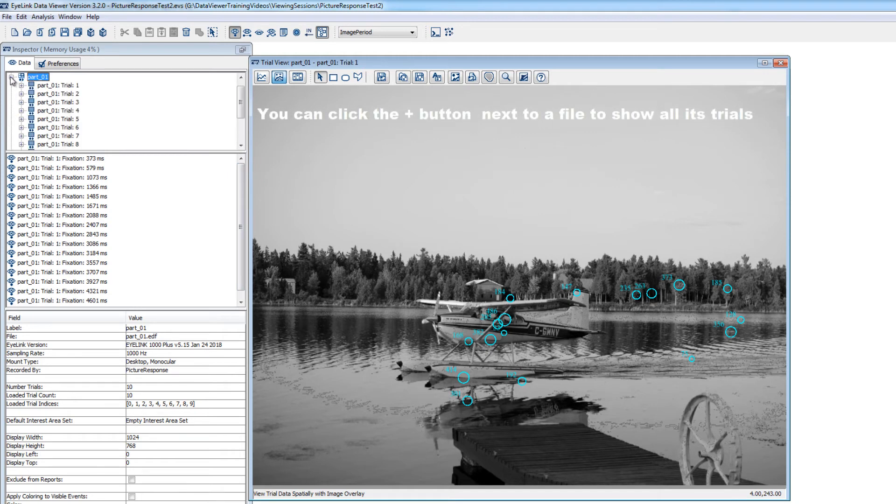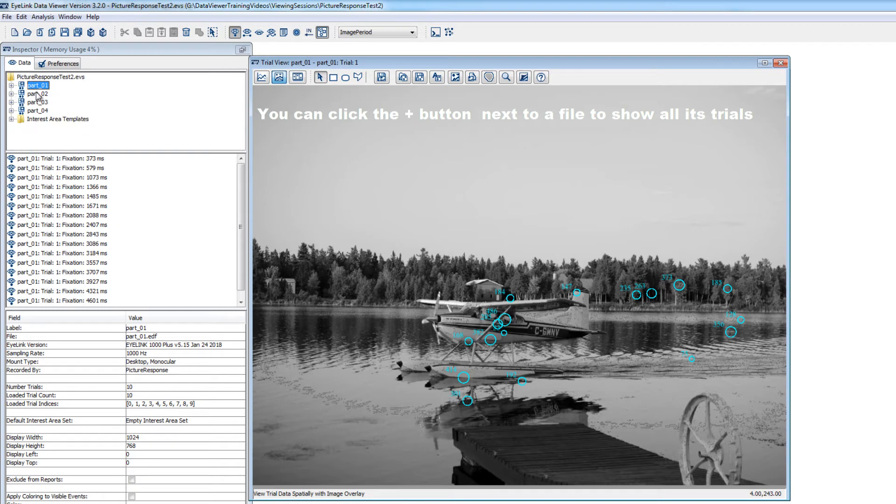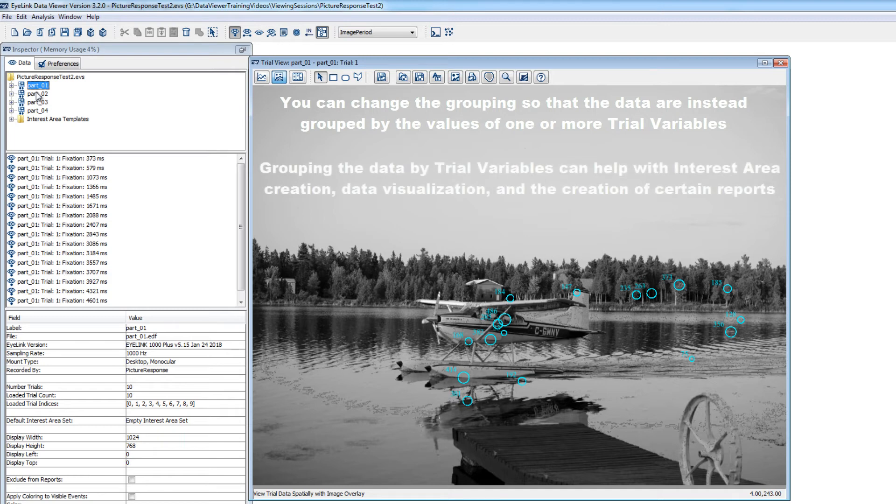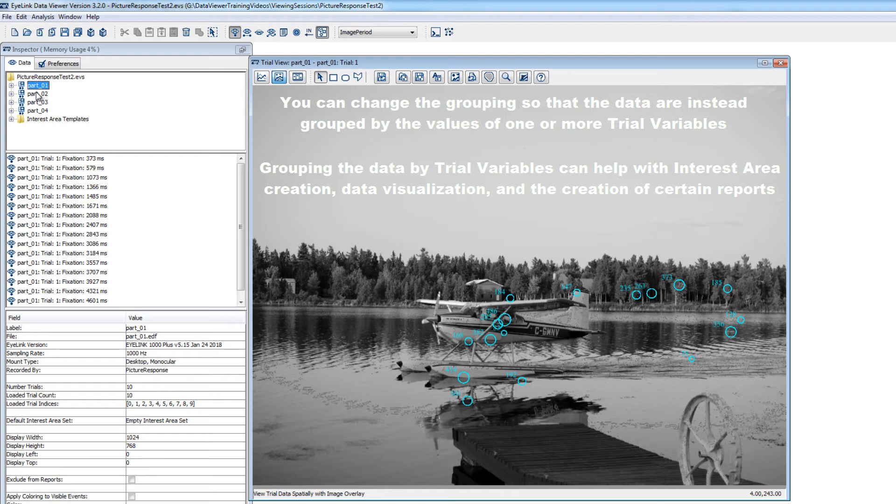For certain steps in the analysis process, it can help to regroup the data in the viewing session so that instead of the data being organized by EDF file name, it is instead organized by the values of one or more trial variables. Doing so allows you to draw interest areas once per distinct trial in the viewing session, and then apply those interest areas to similar trials within or across participants.